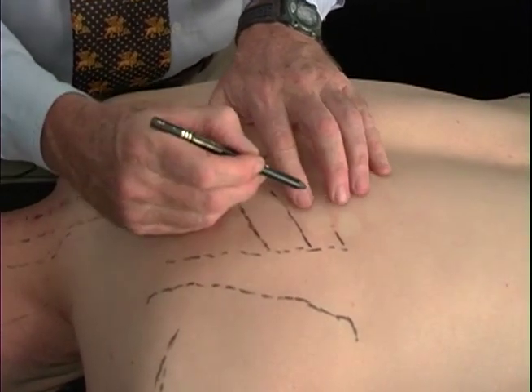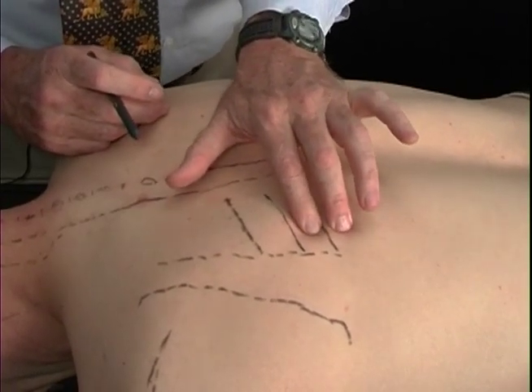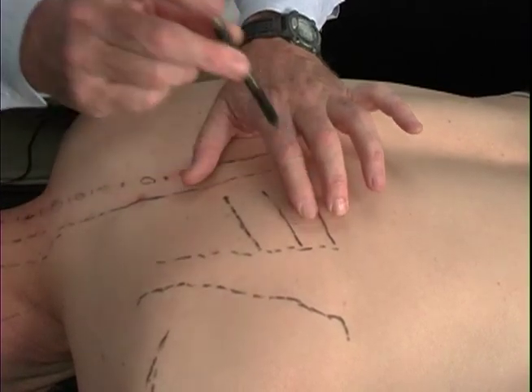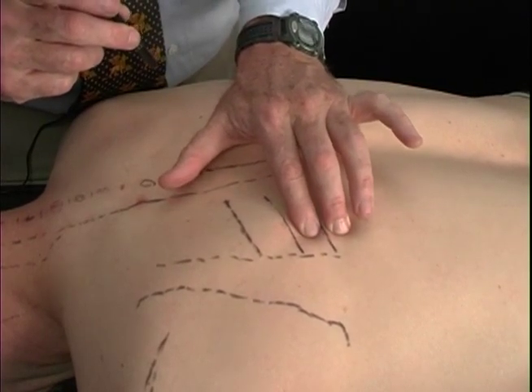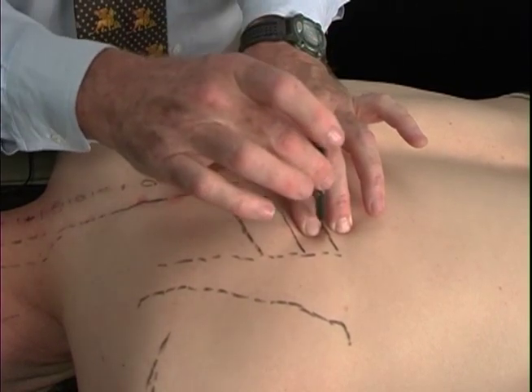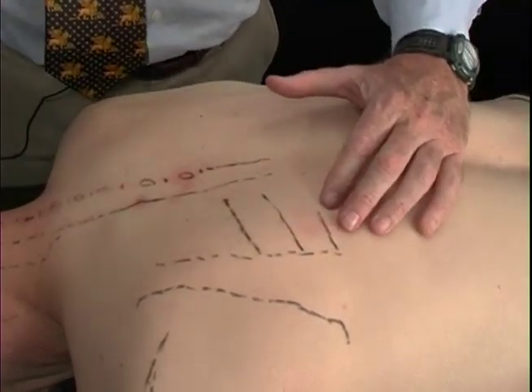There's a rib right there, coming across like this, and another rib right there. And you can see that when I do this technique, I place my fingers on either side of the rib, so I'm locking that rib between my fingers. So I have excellent feel for the rib with a lot of skin compression. You can see how there I'm on the skin level, there I'm pressing the skin down, and I really can lock that rib right between my fingers. So I've got an aiming point to come down onto that rib right at that spot, which is just medial to the angle of the rib.